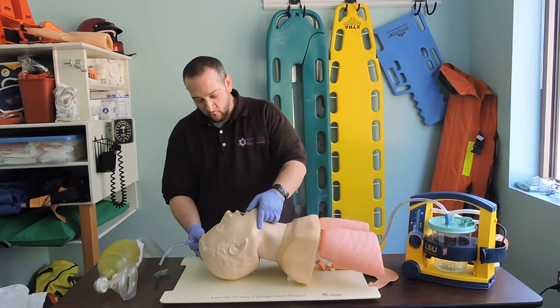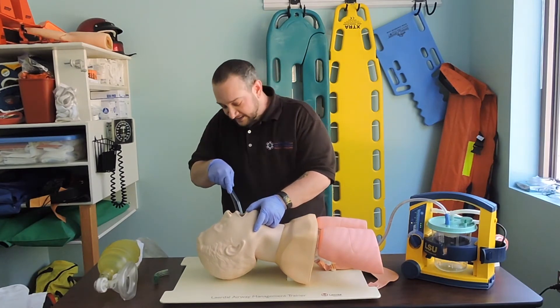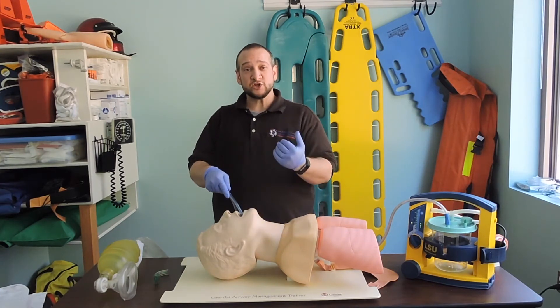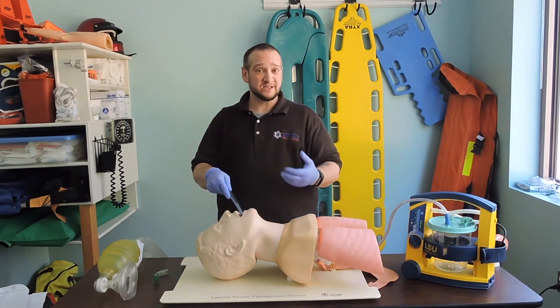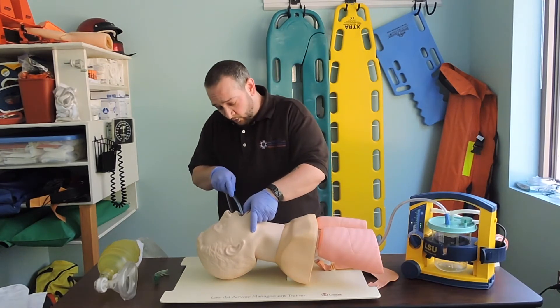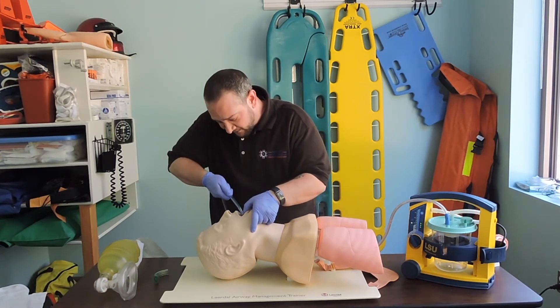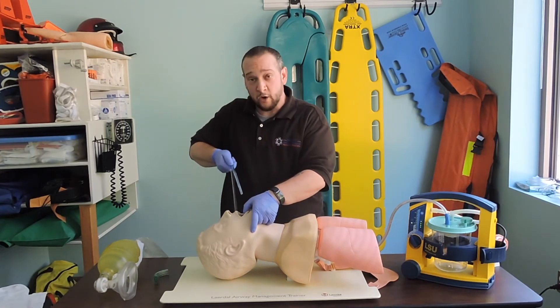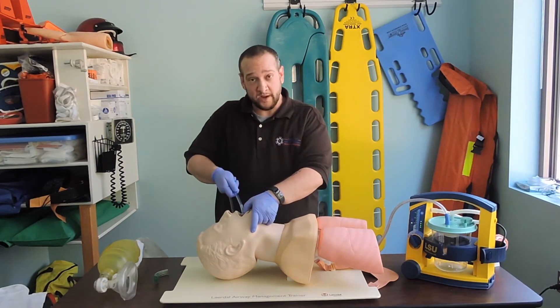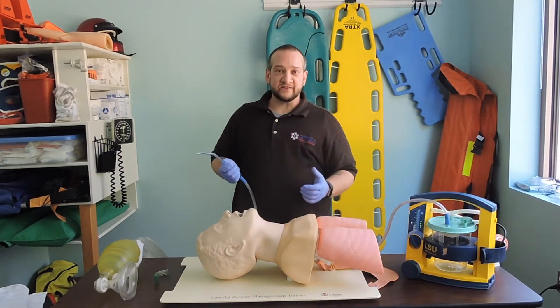If I have the airway open and I'm coming in with my device, I'm going only as deep as I can see. If possible and no C-spine injury is suspected, I can turn the patient on their side to use gravity to help clear the airway. I'm coming in, not losing sight of the distal tip, covering my thumb port — and we suction on the way out, never on the way in. Always on the way out, for no longer than 10 seconds.